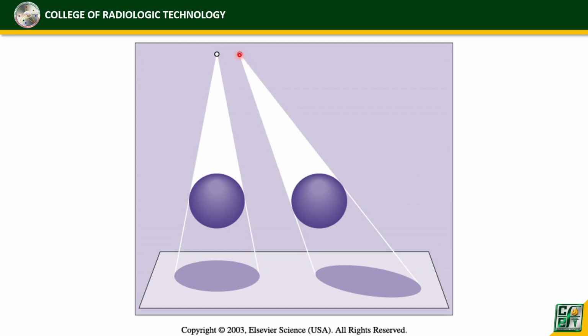Okay, so dito, X-ray tube naka-angulate. Ito, perpendicular. Okay, when we say perpendicular, diretso lang yung central ray or primary beam. Okay, so wala siyang shape distortion. However, meron siyang size distortion, may magnification. Okay, so dito, compare mo, ganito yung itsura, pero pagdating dito, nagkaroon ng angulation ang X-ray tube. So, nagkaroon ng elongation sa shape. Instead na bilog, nagkaroon ng elongation. Nagkaroon ng stretching. Okay?